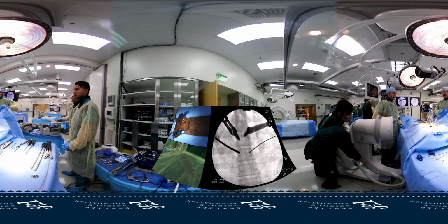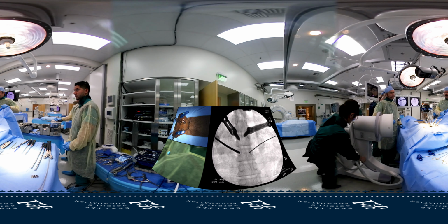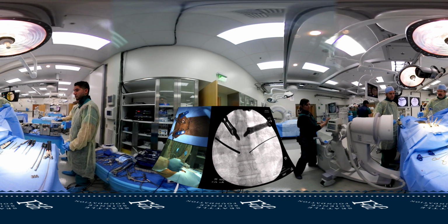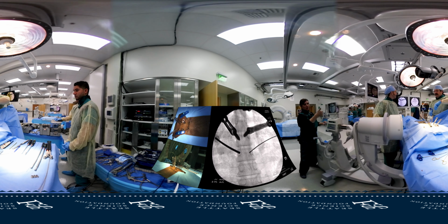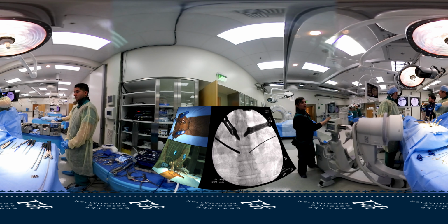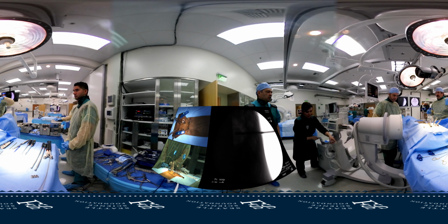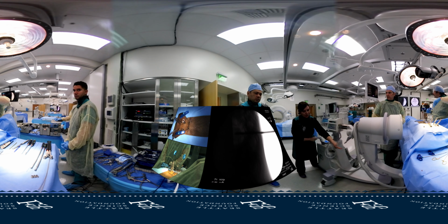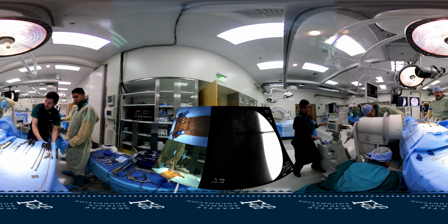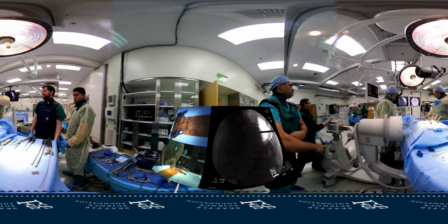So I'll wait till now to go to the lateral, again, just to minimize, for a better workflow and to minimize how much fluoro I get. Come on in and, okay, let's see what that shows. I think it should be good. We were getting it before pretty good. We got something blocking it. Lower the C-arm or raise the table? Yeah, raise the table. Go ahead, raise it a hair. Not sure why. Okay, that's good. Okay. Go ahead. There you go.